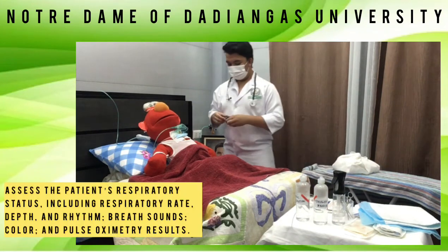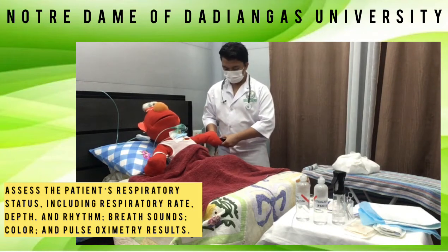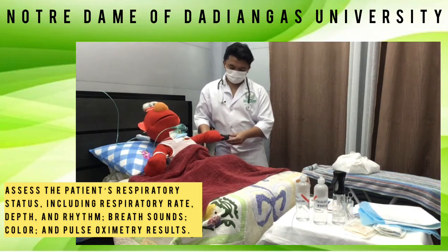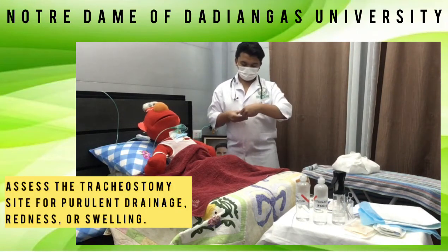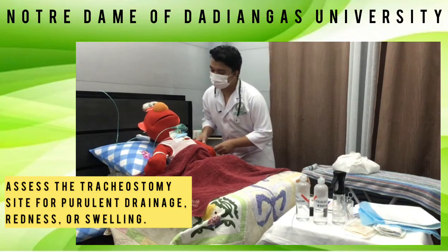Assess the patient's respiratory status, including the respiratory rate, depth and rhythm, breath sounds, color, and pulse oximetry results. Assess the tracheostomy site for purulent drainage, redness, or swelling.